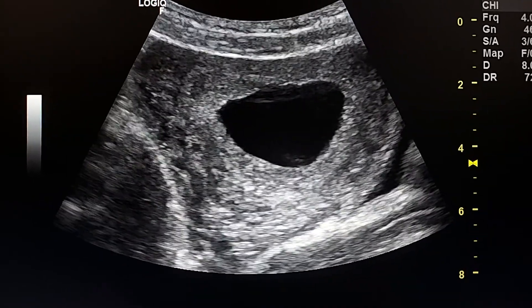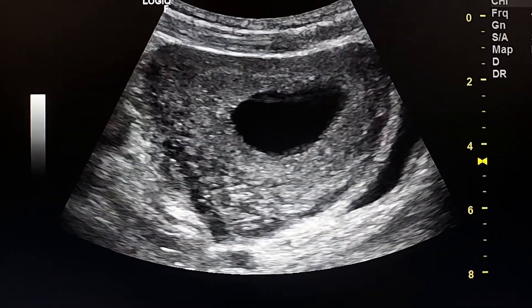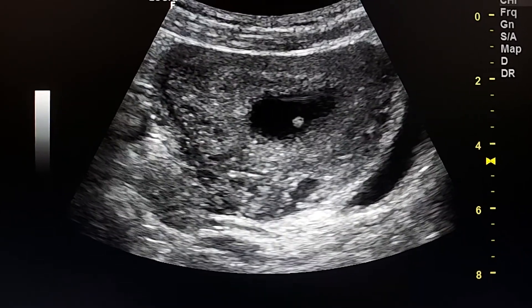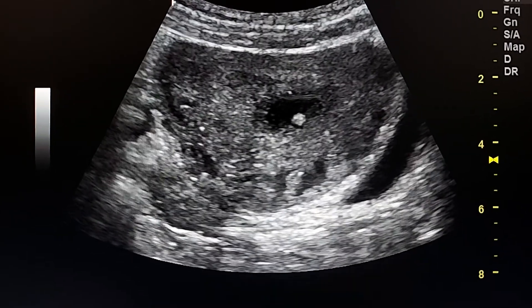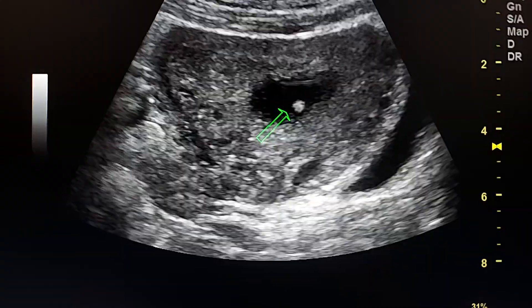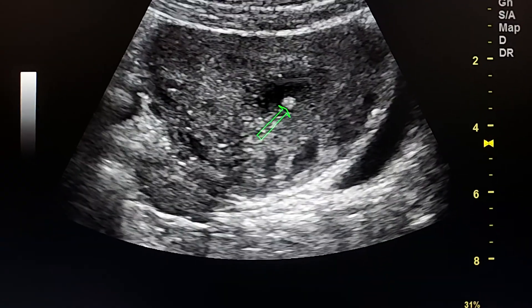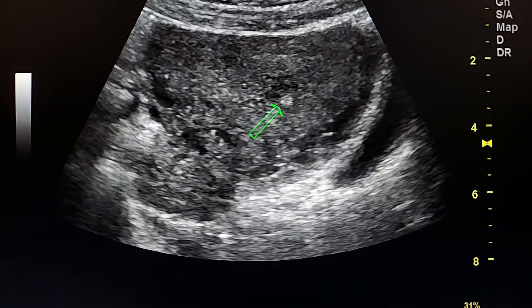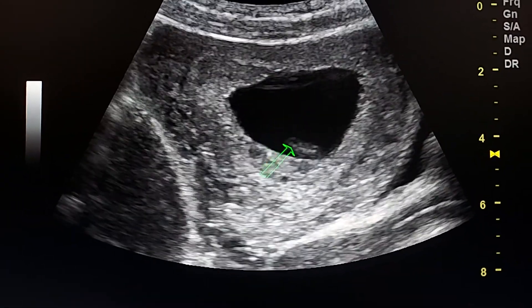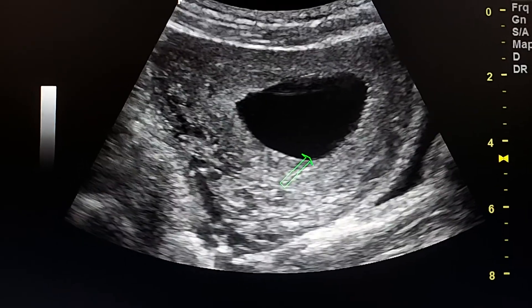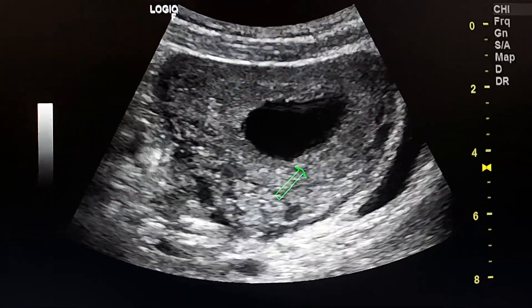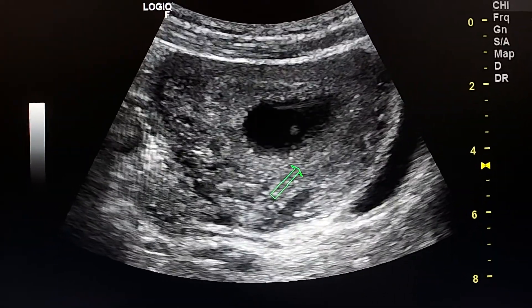There is no fetal cardiac activity. Here we see a calcified yolk sac — this is the calcified yolk sac. And this is the fetal pole.